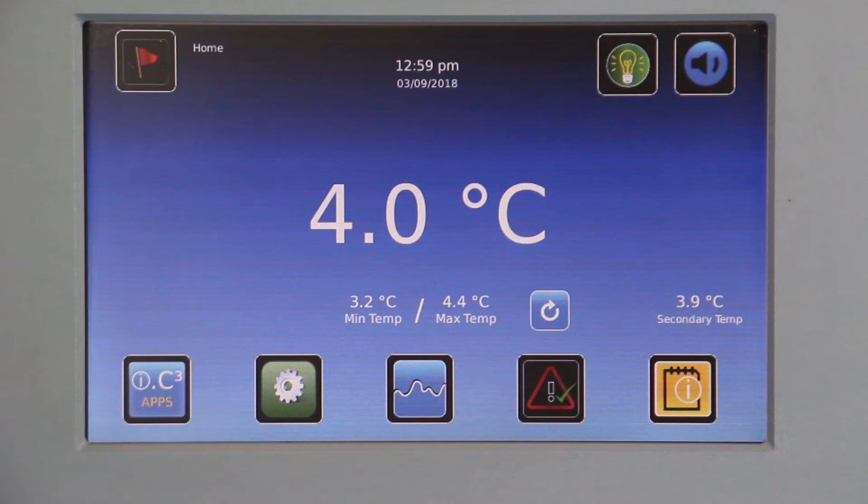This video demonstrates how to check the temperature calibration of I-Series refrigerators and freezers and how to adjust the calibration if necessary.